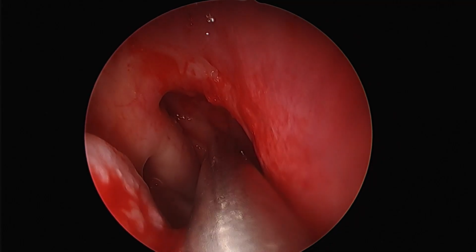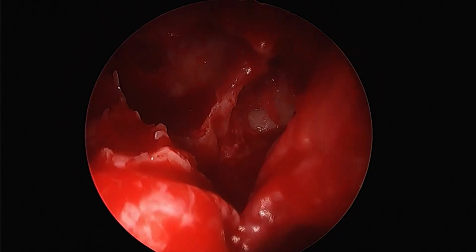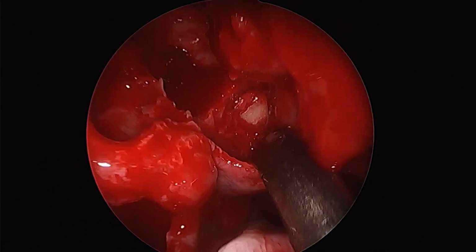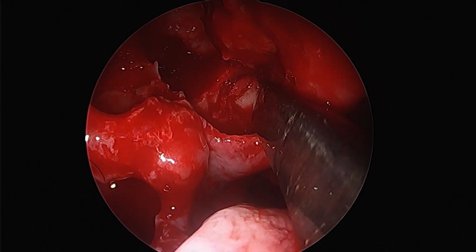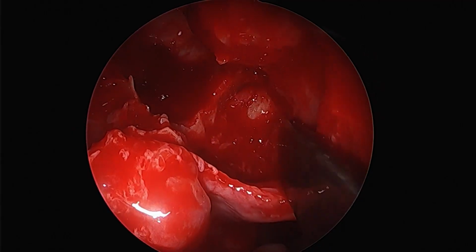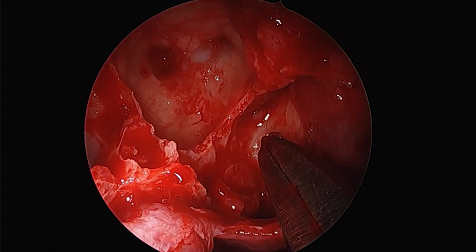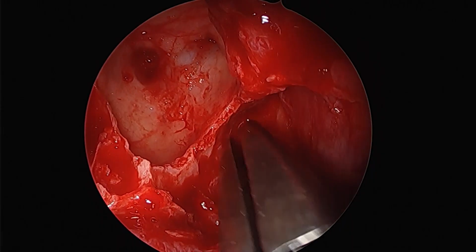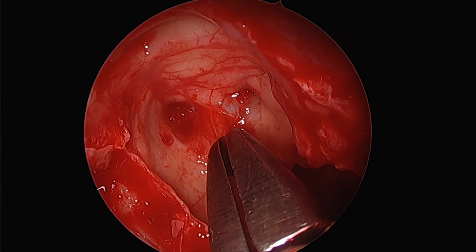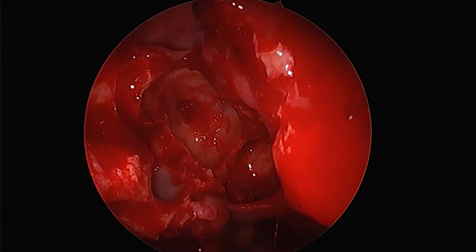You can see that this is the nasopharynx. We go towards the choanal arch, and as we go approximately 10 to 12 millimeters up, we should be able to locate the sphenoid ostium, the sphenoid sinus anterior face, which in some patients of certain ethnicities could become very thick and rigid, and in case of an obstruction may not allow any entry of any standard instruments as such. So this is the posterior ethmoid skull base. As you can see, the fovea and the posterior ethmoids. Now the sphenoid is not yet open.